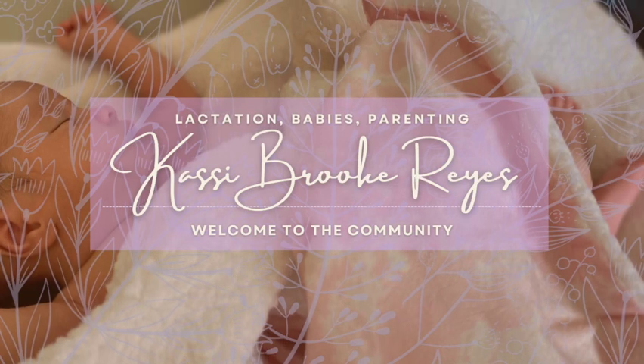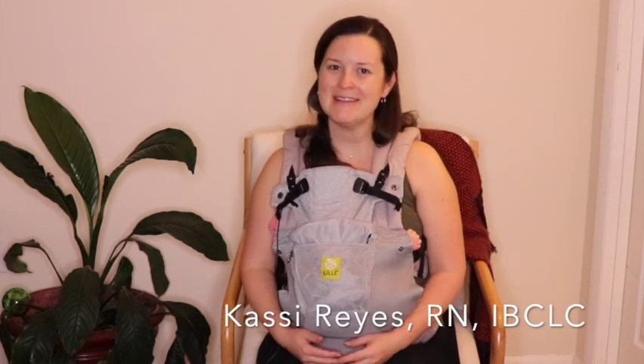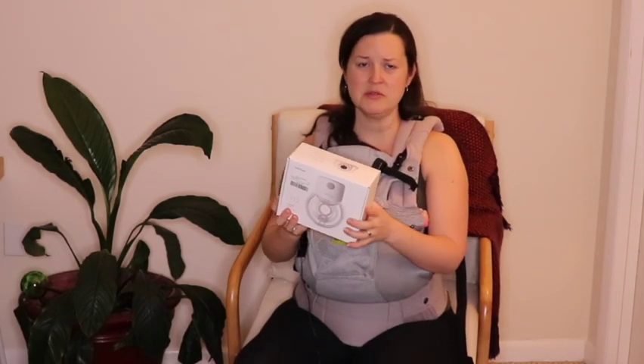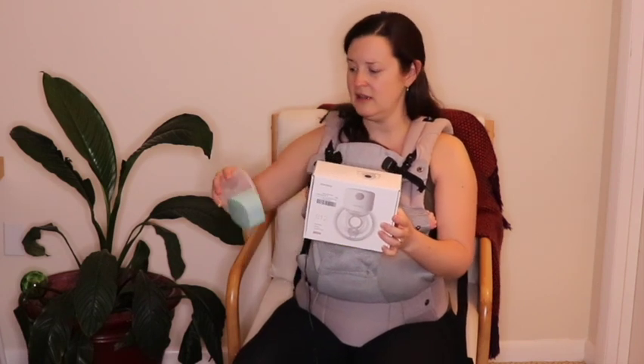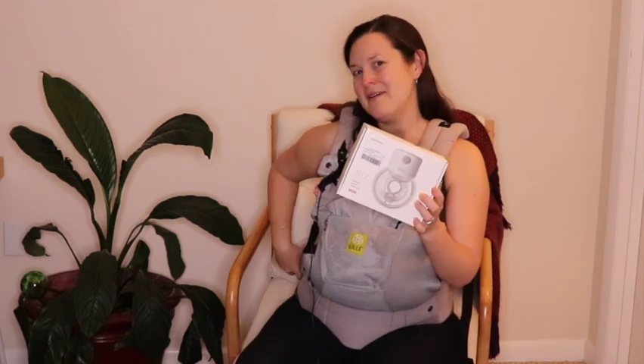Hi everyone, in today's video I'm going to be doing a walkthrough of the Mom Cozy S12 pump. If you're new here, my name is Cassie Reyes — I'm a registered nurse and a board certified lactation consultant. The Mom Cozy company did send me their S12, and if you remember, I have also taken a look at their S9. Now that baby was born, I've been able to try out this pump and I'll give you guys a rundown of how I've been feeling about it.